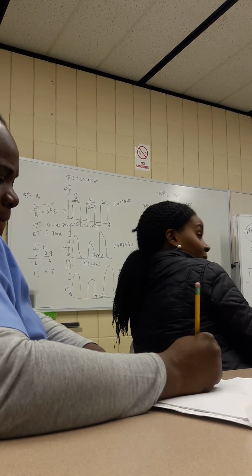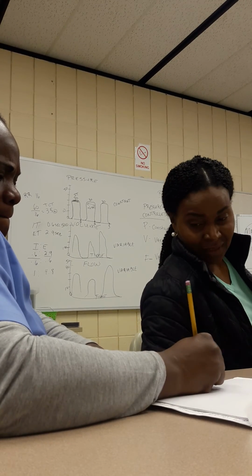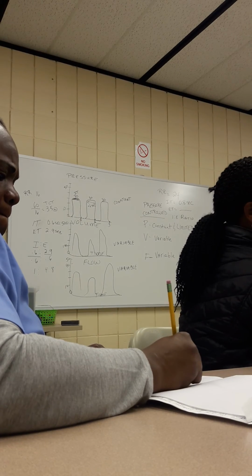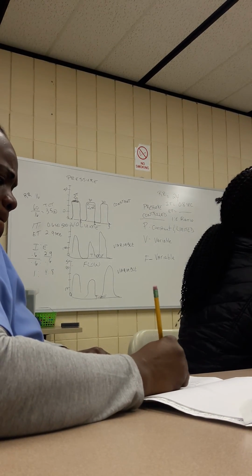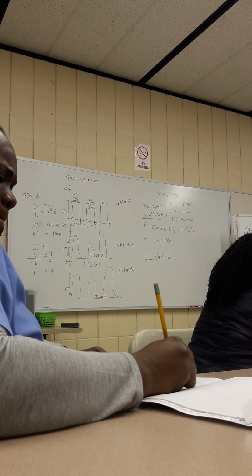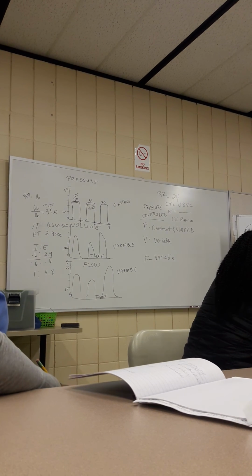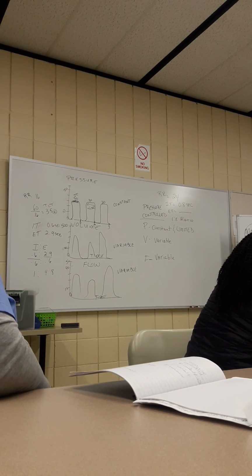It tends to be more for pressure support ventilation. I'm surprised, because we have to be mostly able to use pressure and volume, and I'm looking at this, and I'm like, why is it flow? You mean for the answer? Yeah, the answer is flow.